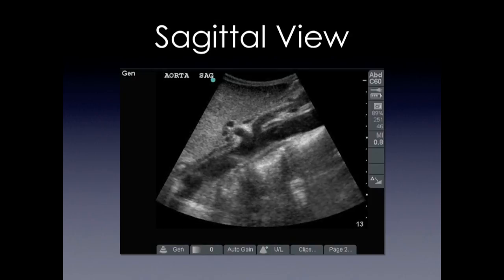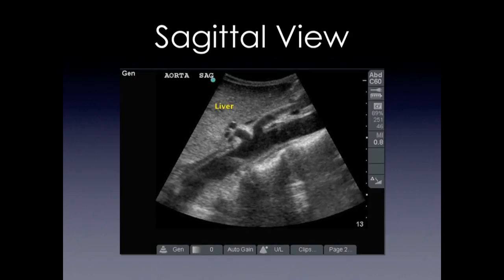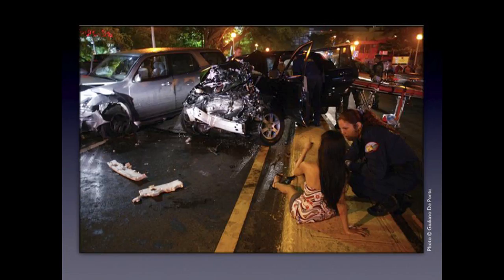Here we have a sagittal view of the aorta. We put the transducer toward the head and you'll see the liver on top, the aorta with the spine line in the inferior portion of your screen, and you're able to see both the celiac and the SMA. So let's talk about the FAST exam.